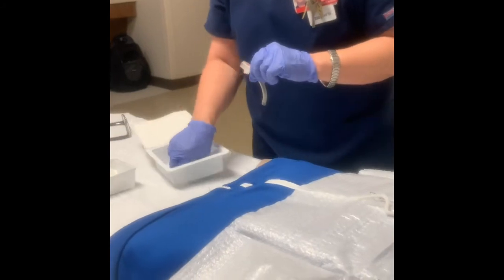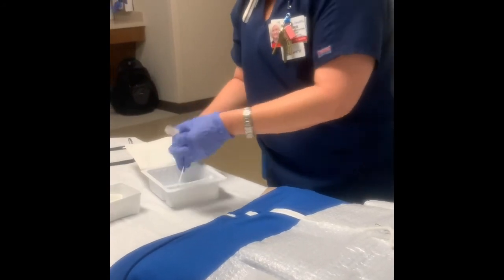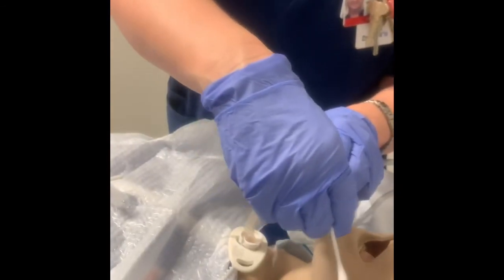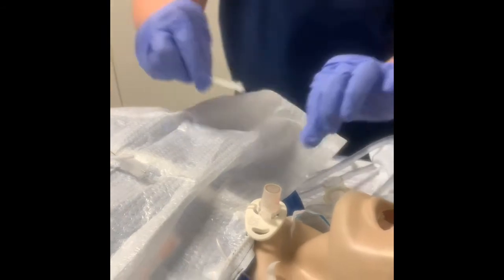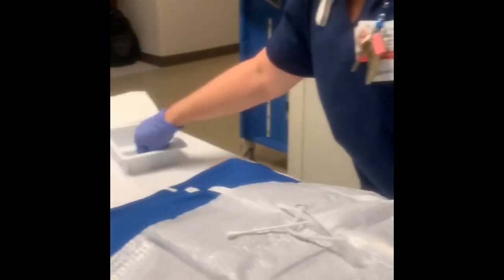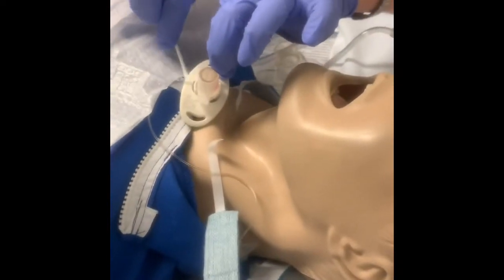You also have the little cotton applicators that you can use to clean underneath your trach. But I usually like to get my inner cannula back in. A lot of times it's a little bit easier. You put it towards the head and give it a little twist around, okay? You want to clean those crusts, like I said, underneath there. Clean all these crusts that happen to be around your trach. Discard this one, and don't keep reusing. If you think you need more, then get more sterile applicators and clean underneath here.